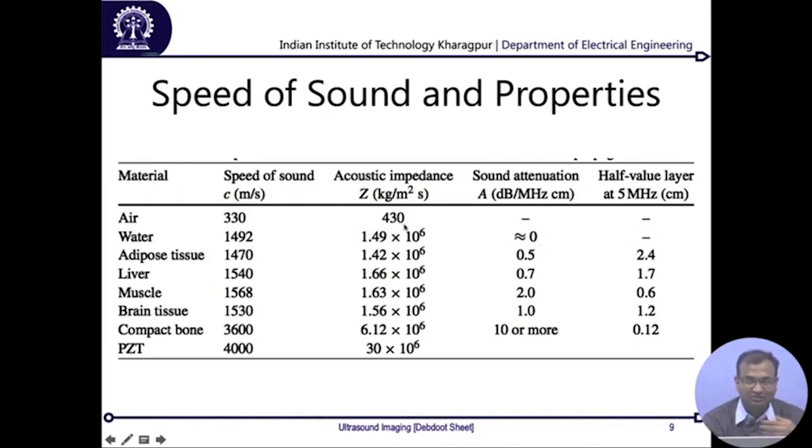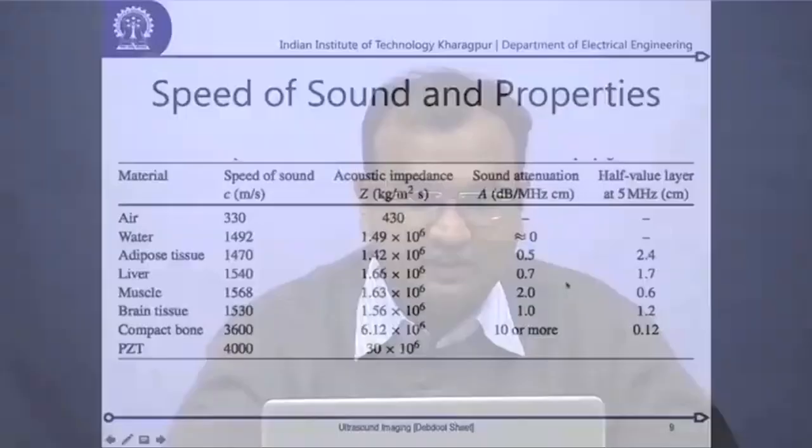basically multiple people can hear over longer distances, whereas over here, since the acoustic impedance is much higher, it will die much faster. So, this is the reason why your depth of ultrasonic imaging is very much limited. You cannot just go for an infinite depth of ultrasound imaging, you have a very finite depth, because after some time you are just going to lose all viable amplitude and will just be getting a lot of noise coming to you, okay.